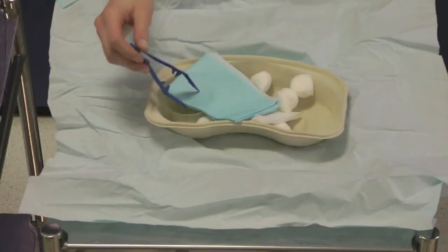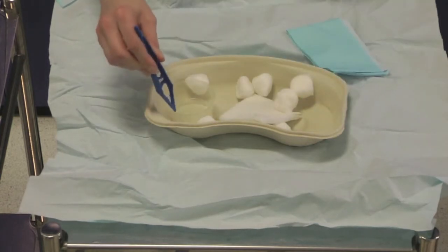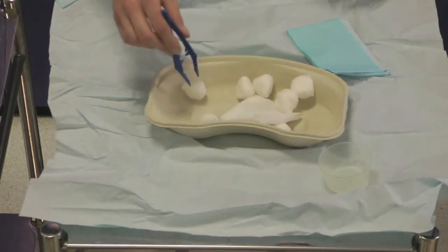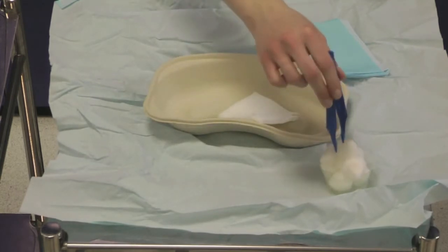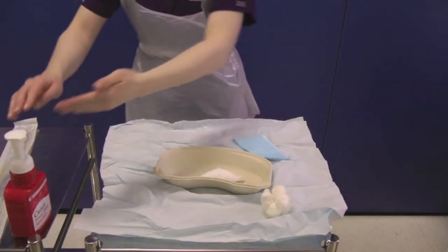Take your sterile forceps and organize the contents of the catheter pack, placing the cotton wool balls into the sterile pot. Discard the forceps into the sharps bin and decontaminate your hands.